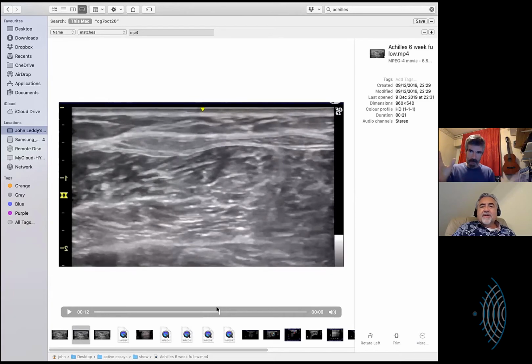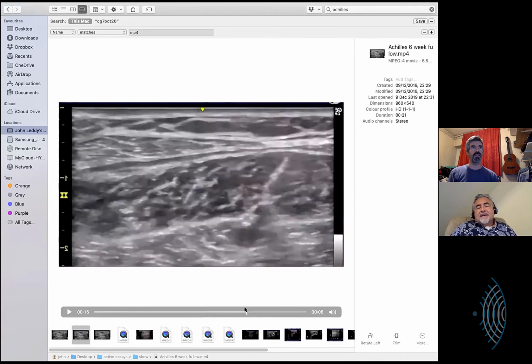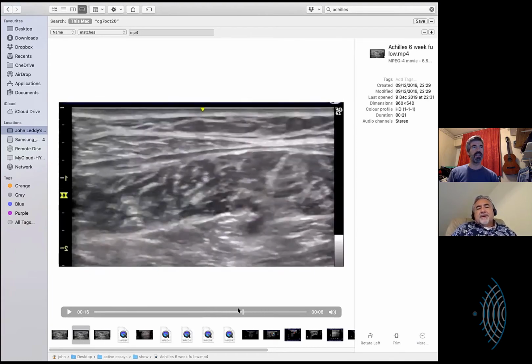And by running the probe over, that's where the dynamic bit is. As you run, you'd only see it as you scan through. You don't see it on a still picture, but you get that swirling sensation. And that's what draws your eye across to where everything is going. There's that one. There's the tendon.